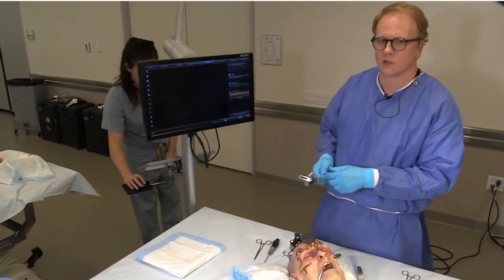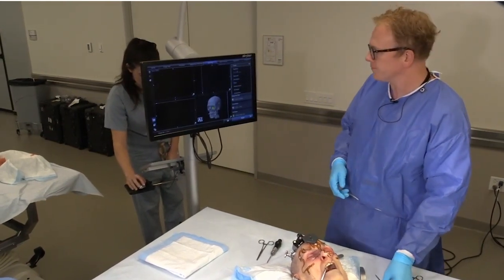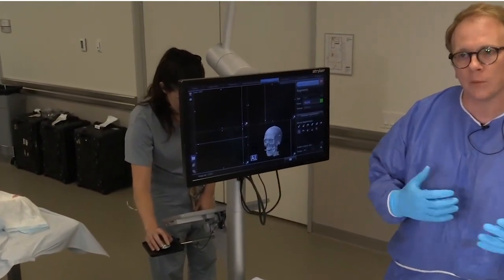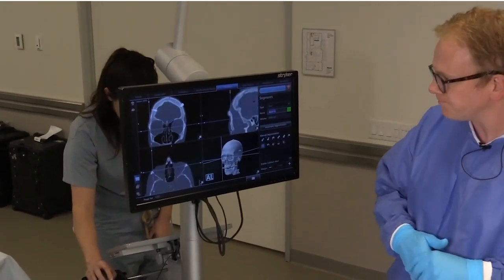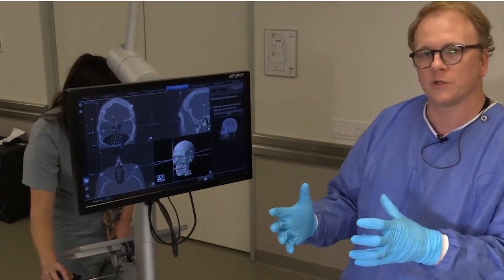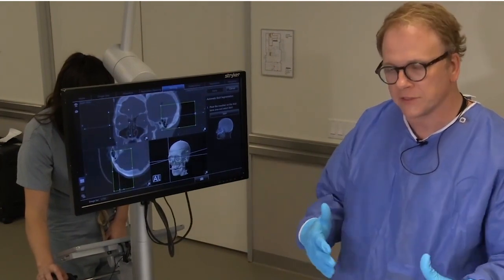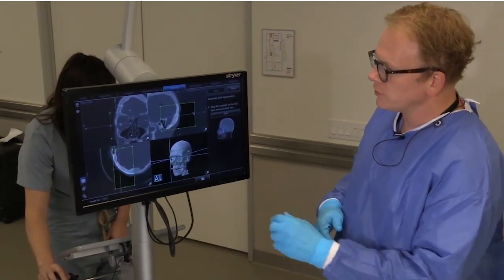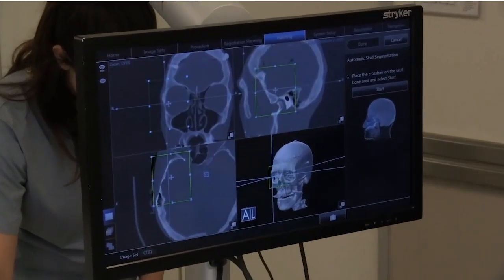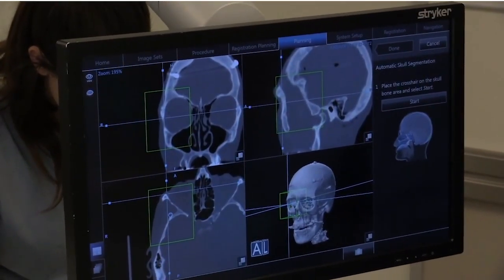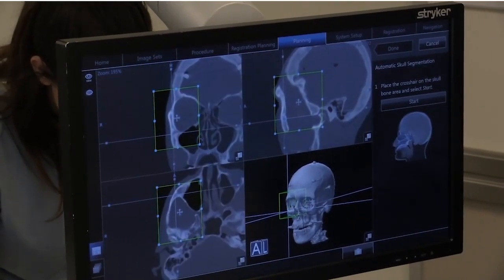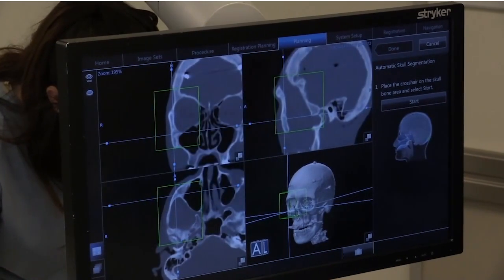A higher level of fidelity, which is actually very useful in the software, is using mirroring technology. We're able to use the uninjured orbit to create a perfected anatomical data set to help guide our orbit reconstruction. This requires an initial step using a bounding box — we isolate what we consider to be normal anatomy on the opposite, uninjured side of the face, then create a bounding box around that orbit.